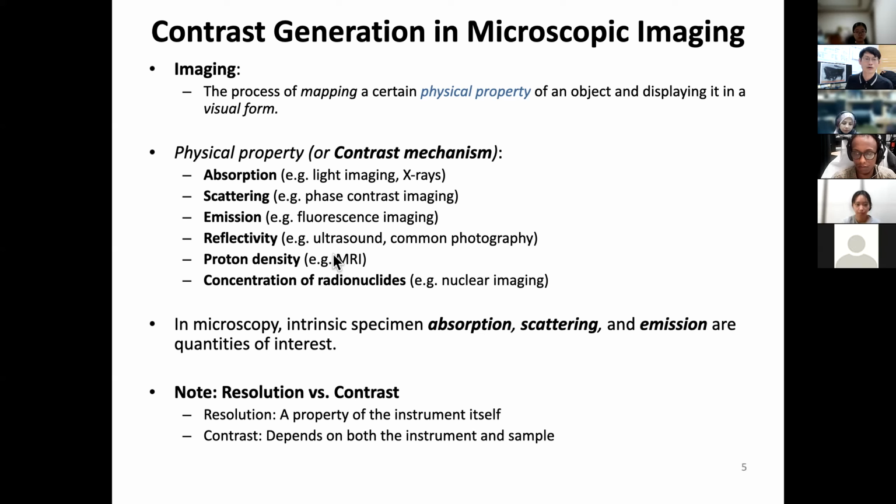Another one I want to discuss is nuclear imaging. That is also a very special contrast. The reason is that we are using radionuclides, which give a gamma ray, and you put this atom into a molecule, for example a glucose analog, and inject it into the body.